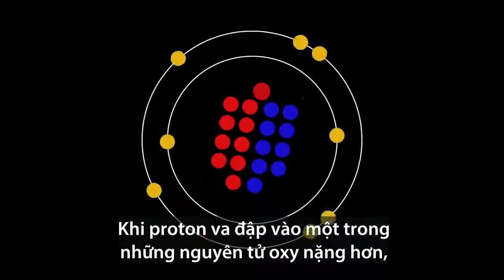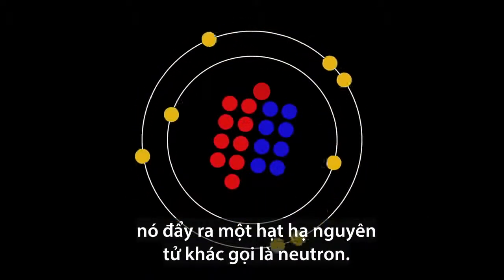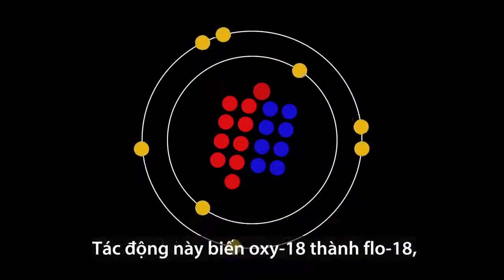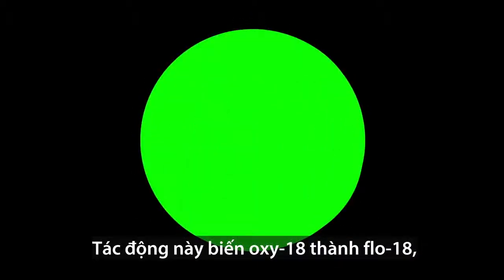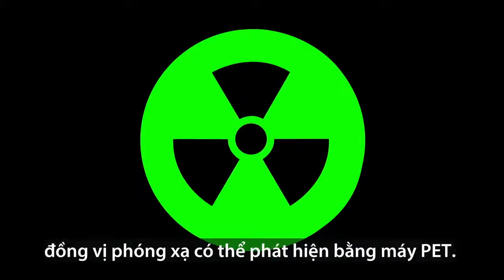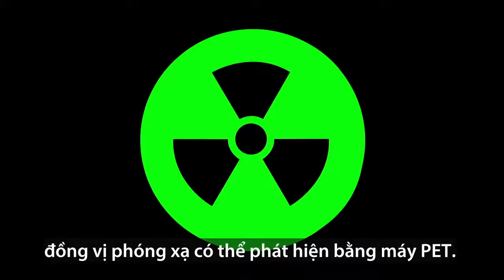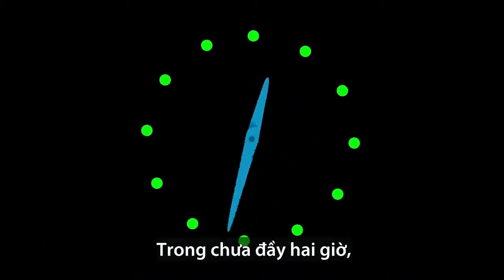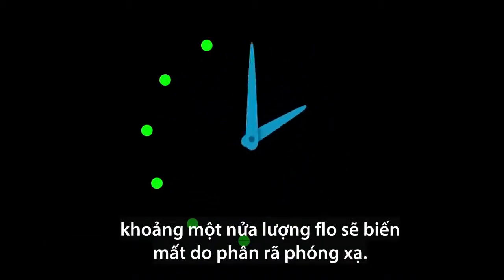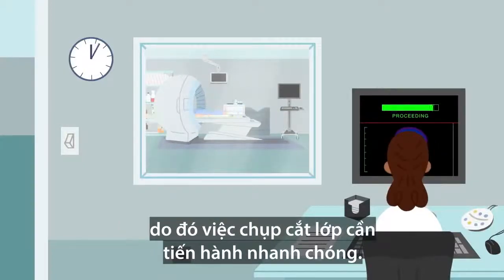When a proton slams into one of these heavier oxygen atoms, it kicks out another subatomic particle called a neutron. This impact turns oxygen-18 into fluorine-18, a radioactive isotope that can be detected on a PET scan. In a little under two hours, about half the fluorine will be gone due to radioactive decay, so the clock is ticking to get the scan done.